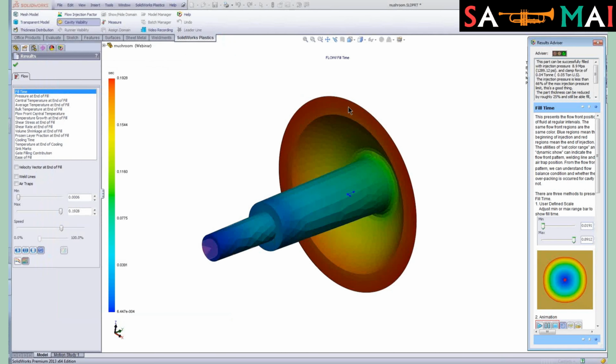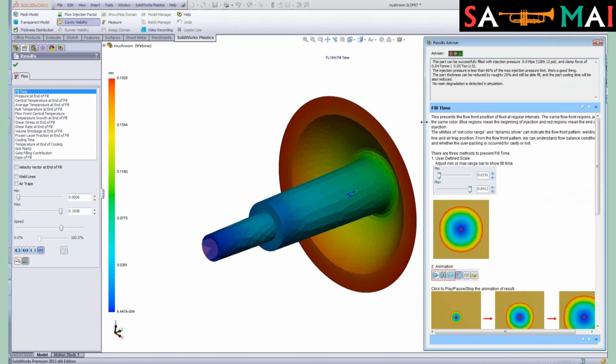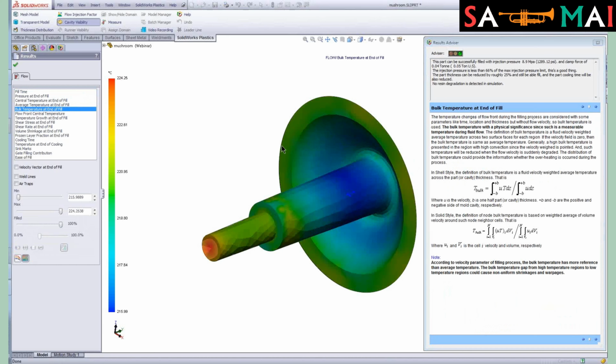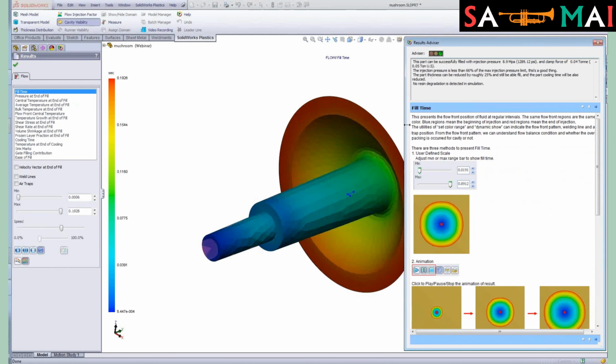So let's go ahead and exit that, and let's take a look at some of the features inside Plastics Professional. First you'll notice I have a results advisor on the right-hand side of the screen. This shows up at the end of every plastic simulation that I do, so if I'm not an expert in injection molding, anytime I change any of these plots, I get real-time feedback on the results advisor for basically what this plot would mean to me as a designer or an engineer.